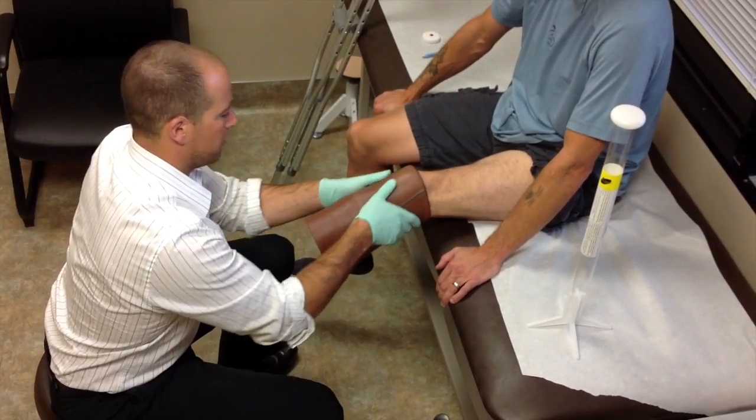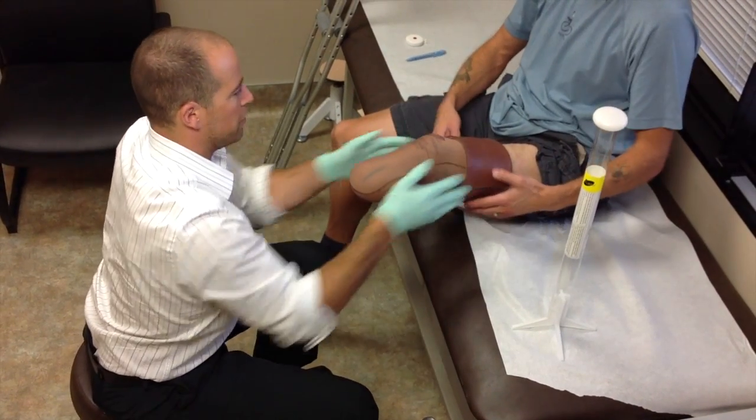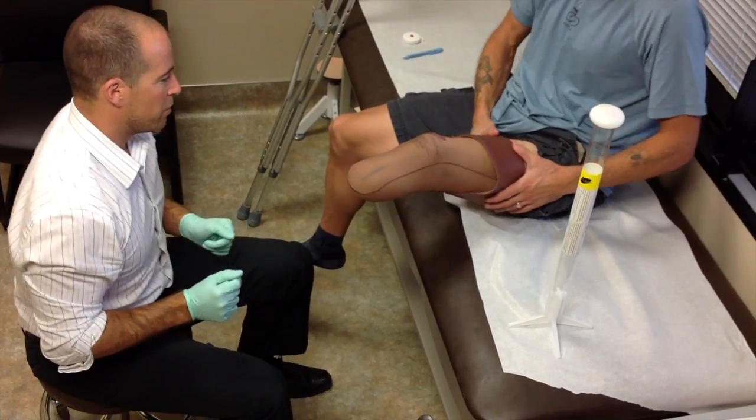Remember that you're going to be wearing your gel liner in your socket and in your prosthesis, so your practitioner is actually going to cast over the top of the liner as well.